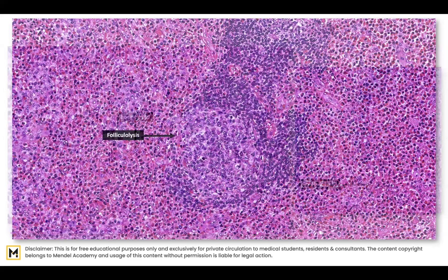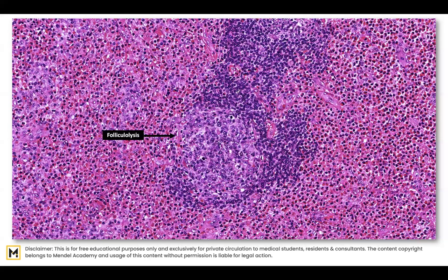This is another picture where it is even more clear. You can see the mantle zone — the dark lymphocytes — and the germinal center, the pale area. There is a breach in the mantle zone: the follicle has been lysed and is being invaded by the pink-colored eosinophils. The whole paracortex is full of eosinophils and they are entering into the follicle. This is an important feature.